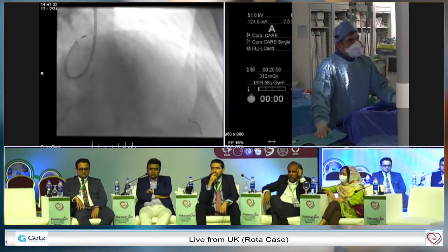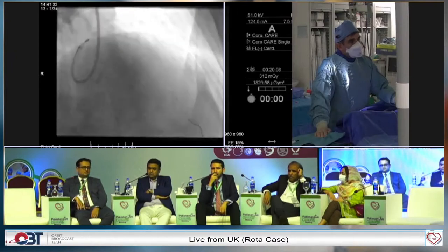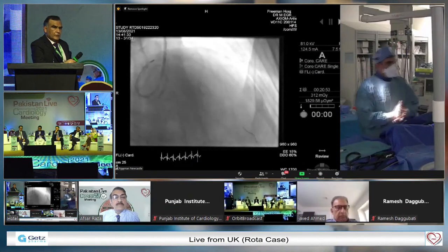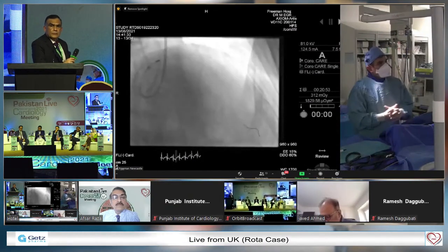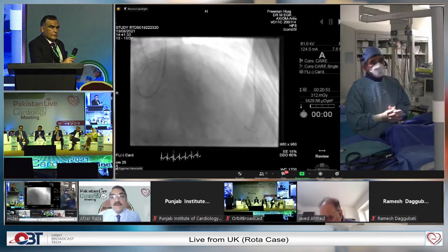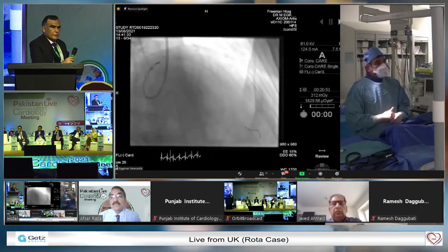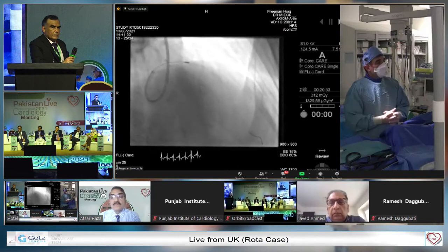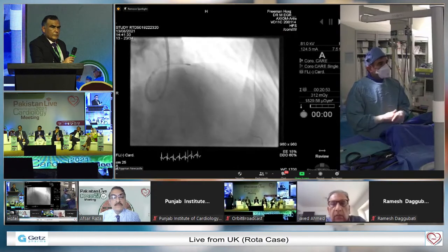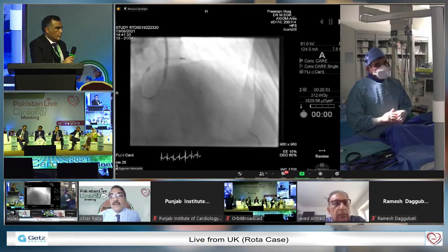Mohanad, which microcatheter did you use to exchange the wire? I used a Corsair 135 centimeter. Because with the calcium and the severe narrowing, quite often I'll use an over-the-wire balloon, if I think I could deliver it. Just cost saving, I suppose: instead of paying £310, you pay £40 for the balloon. But in a case like this, I think there's no chance of the balloon going, and no point of trying. So I went straight for a Corsair.